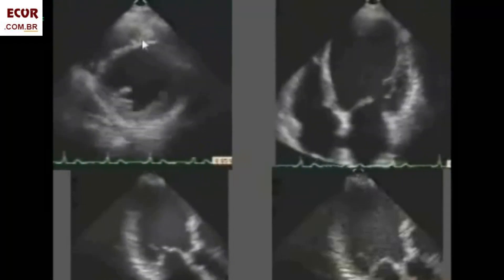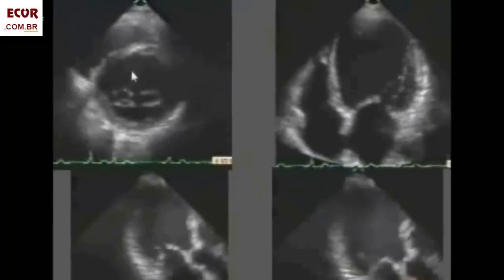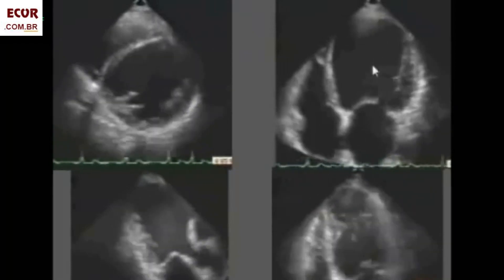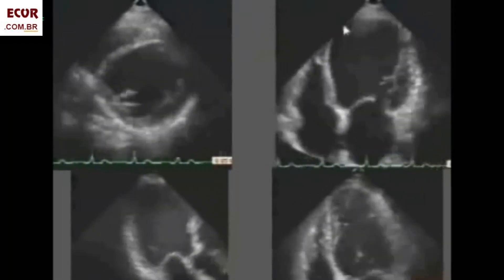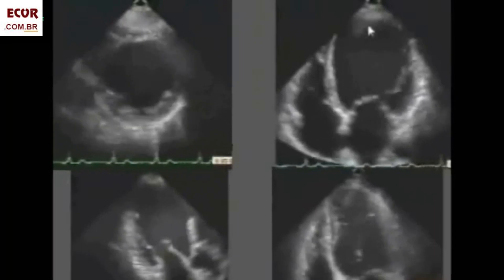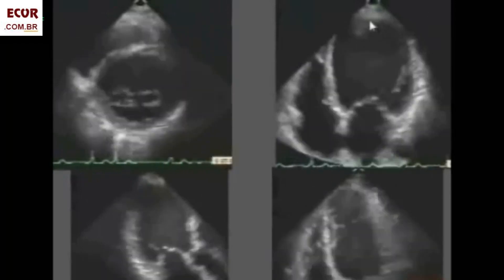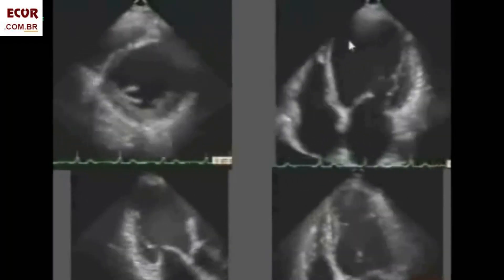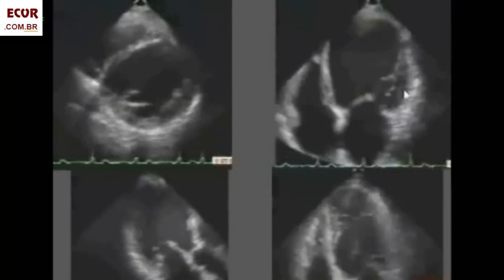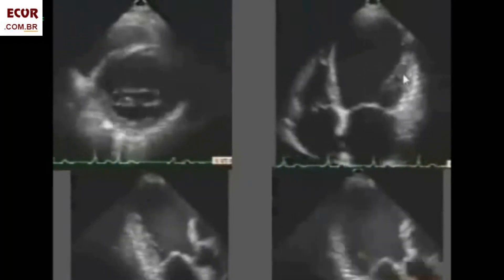It's fibrotic because it's thin and brighter than the usual wall. The remaining wall seems to be contracting well. Even though this area is fibrotic, we cannot say it's an aneurysm yet. In this four-chamber view, the apex is dilated — very dilated. It's dyskinetic. The wall is pretty much thinner than the others. But I don't really see a neck. Most people would call this an aneurysm already — it might as well be — but I'd rather have the complete findings, and one of those findings is the sudden thinning of the wall showing where the neck of the aneurysm is.